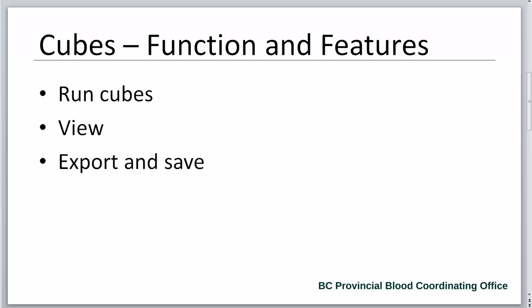This video provides information about how to access and manipulate the cubes in the Transfusion Medicine Data Portal. We'll take a look inside at our test system again and the data that is available and can be manipulated.